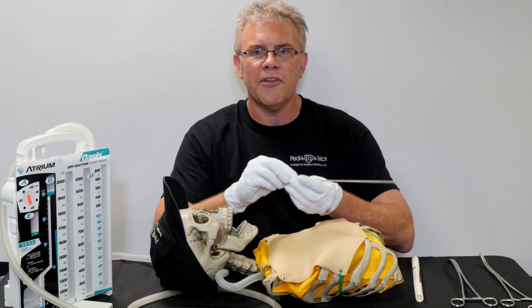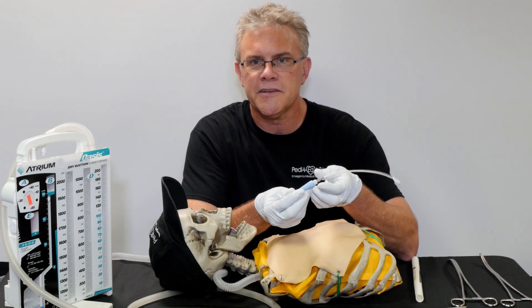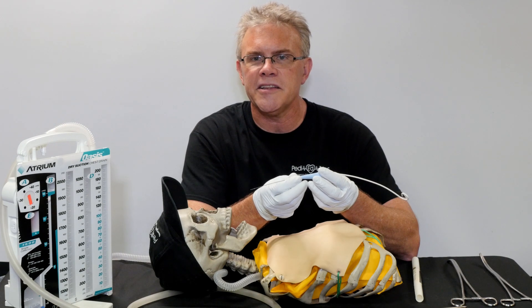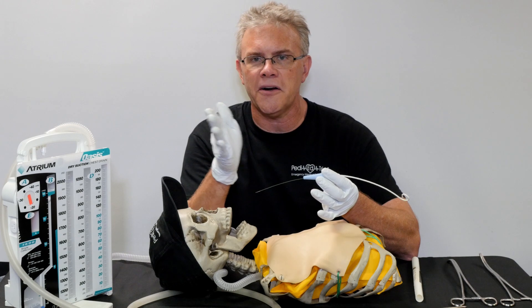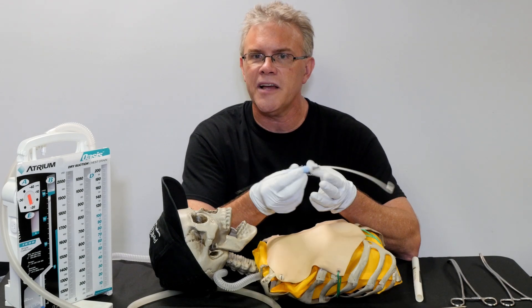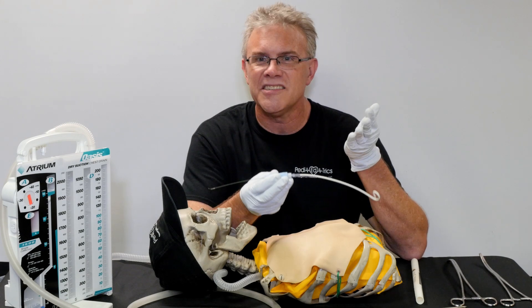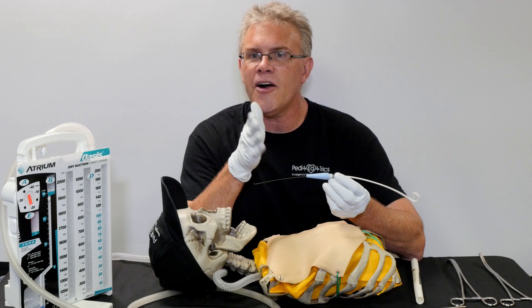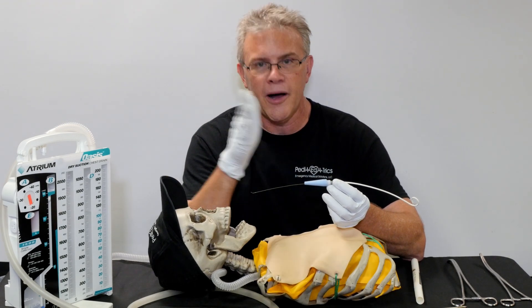The other neat thing involves pigtails. Pigtails started off with little babies, then kids, and now more and more places in the ER and upstairs are using pigtail chest tubes as well. And these, if you've played with them, are really slick. The idea being especially for air — air is going to come out whether you have a big tube or a little tube, it's going to come out.